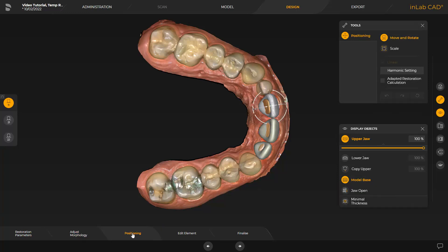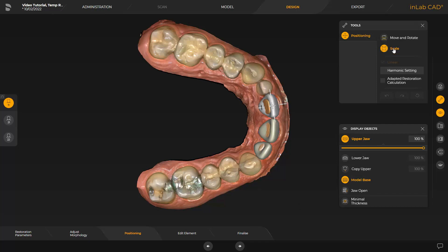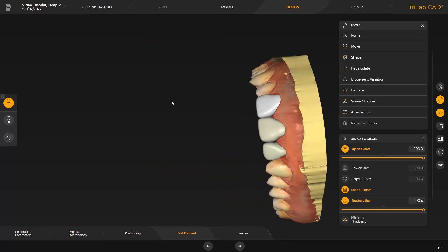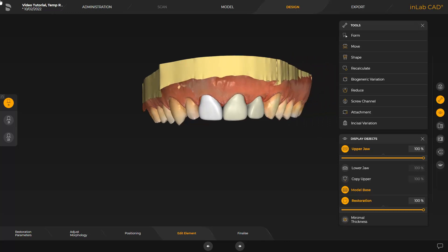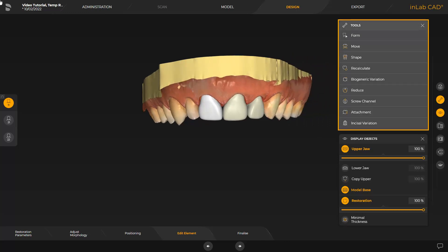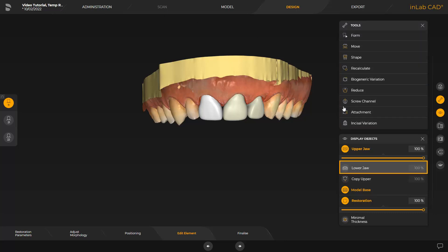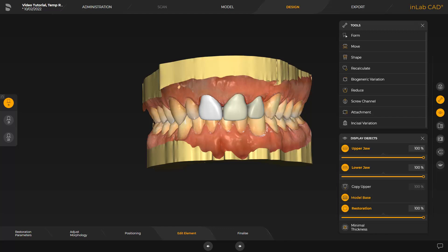Here, the software generated a positioning proposal which can be adjusted with the tool of the same name. You can choose between the two options, Move and Rotate and Scale. Again, we accept the software generated proposal and initiate the calculation of the temporaries by tapping the next step, Edit Element. This step also offers a range of tools which we will not apply in our case. We enable the lower jaw and check the positioning in relation to the opposing bite.